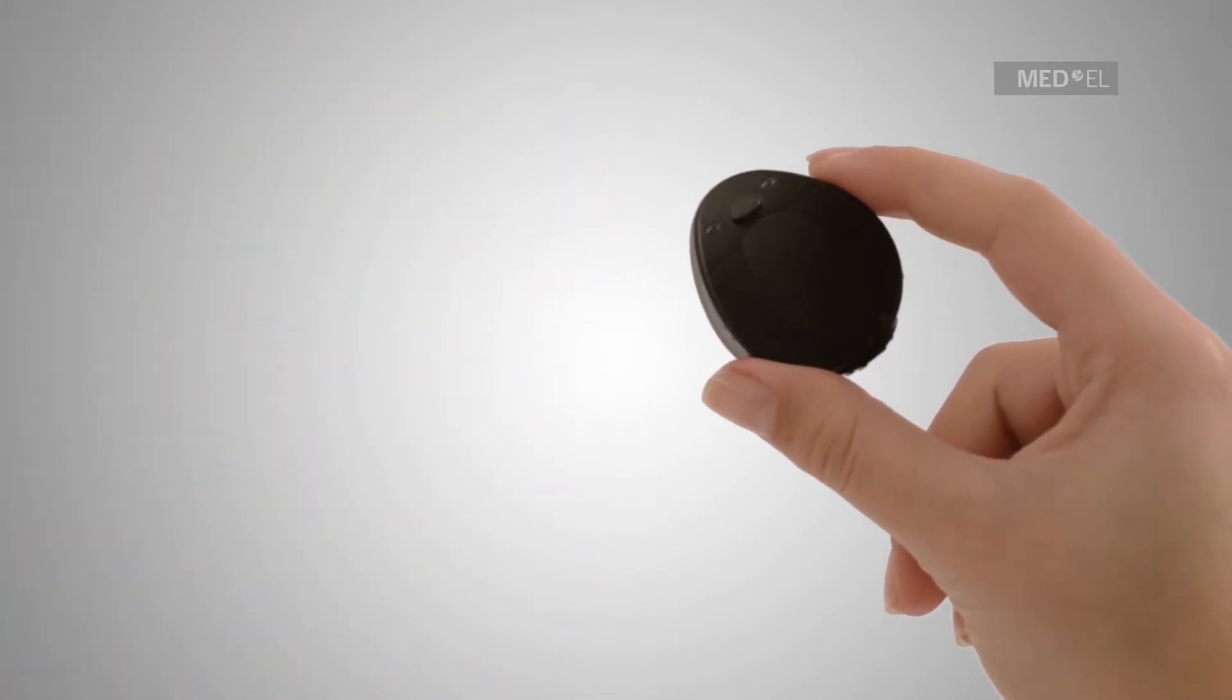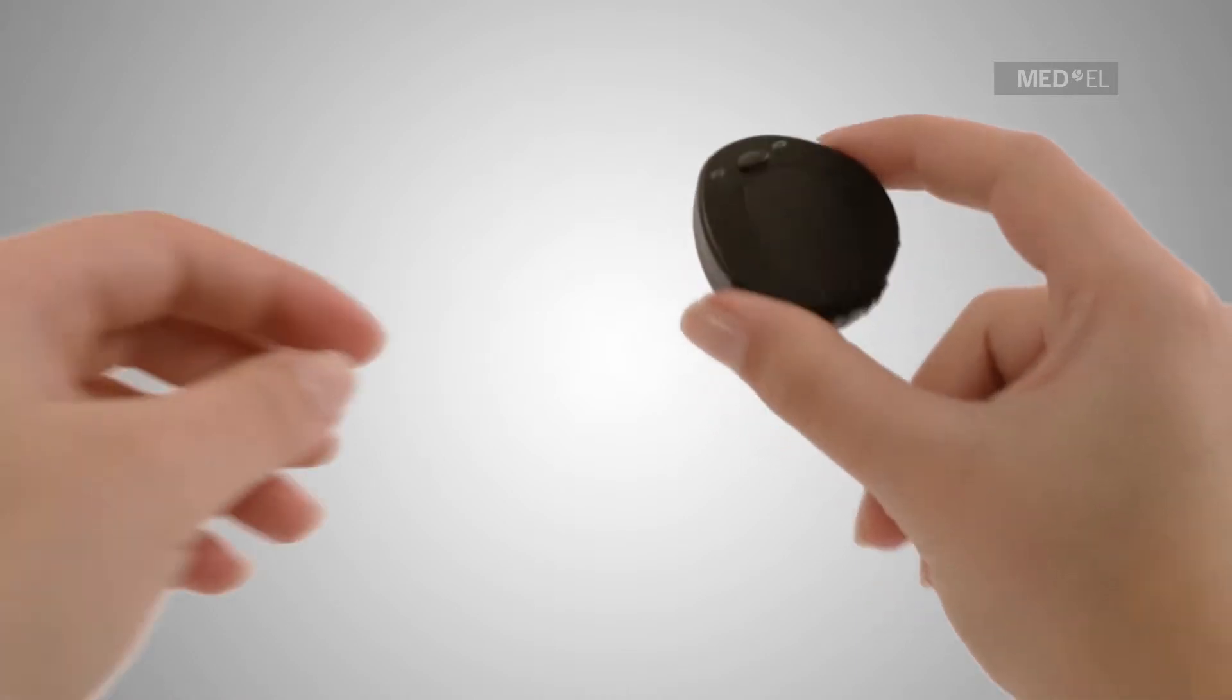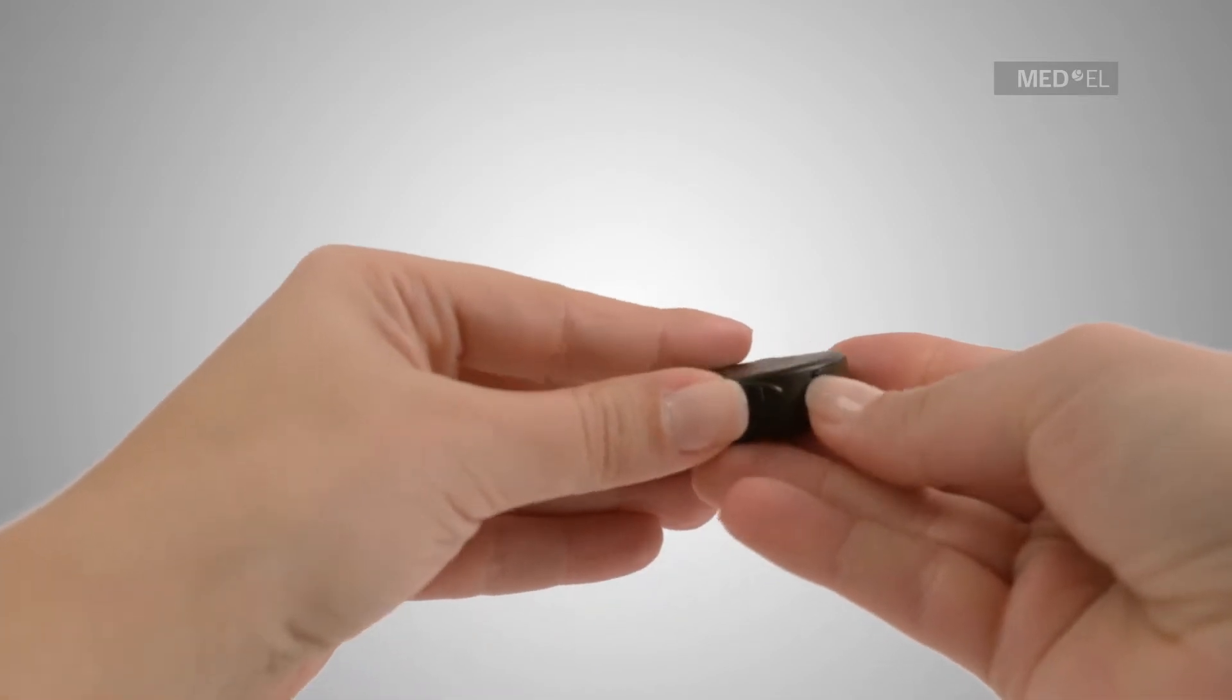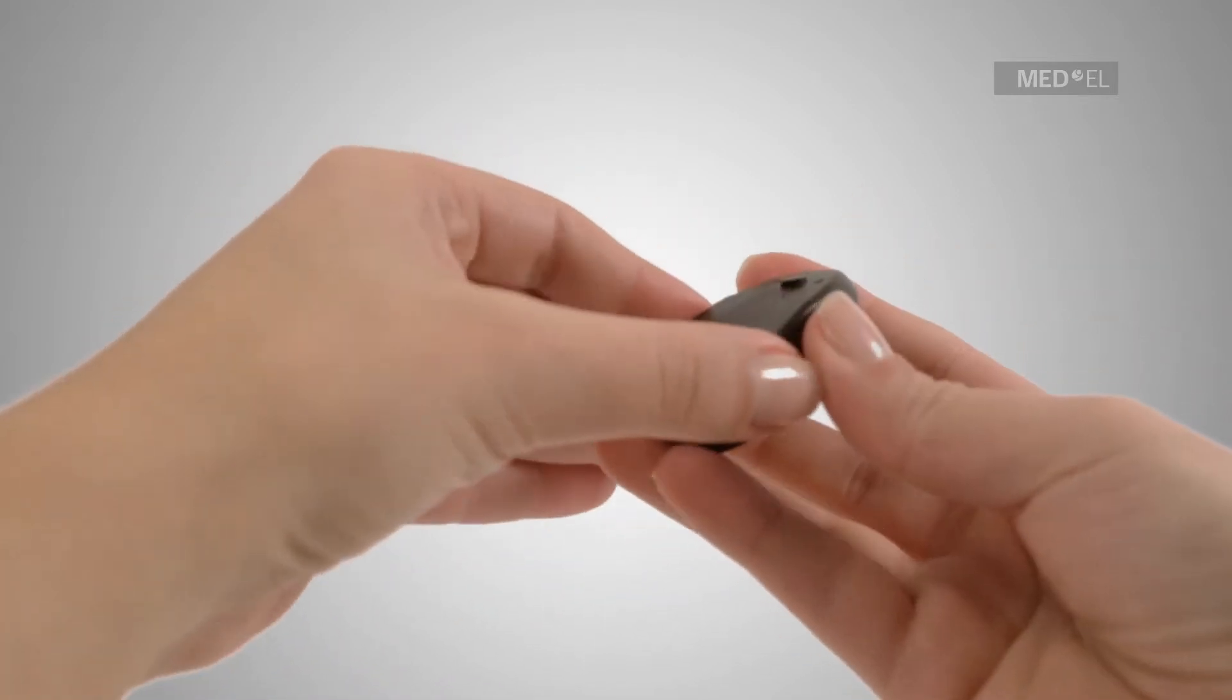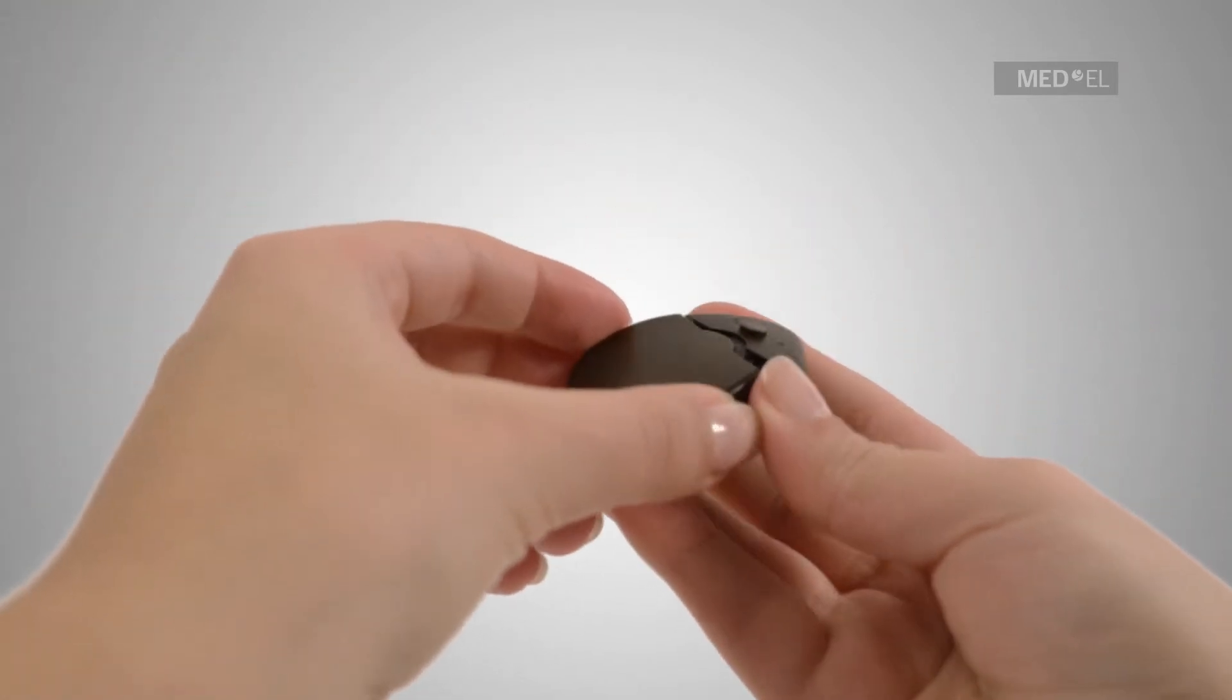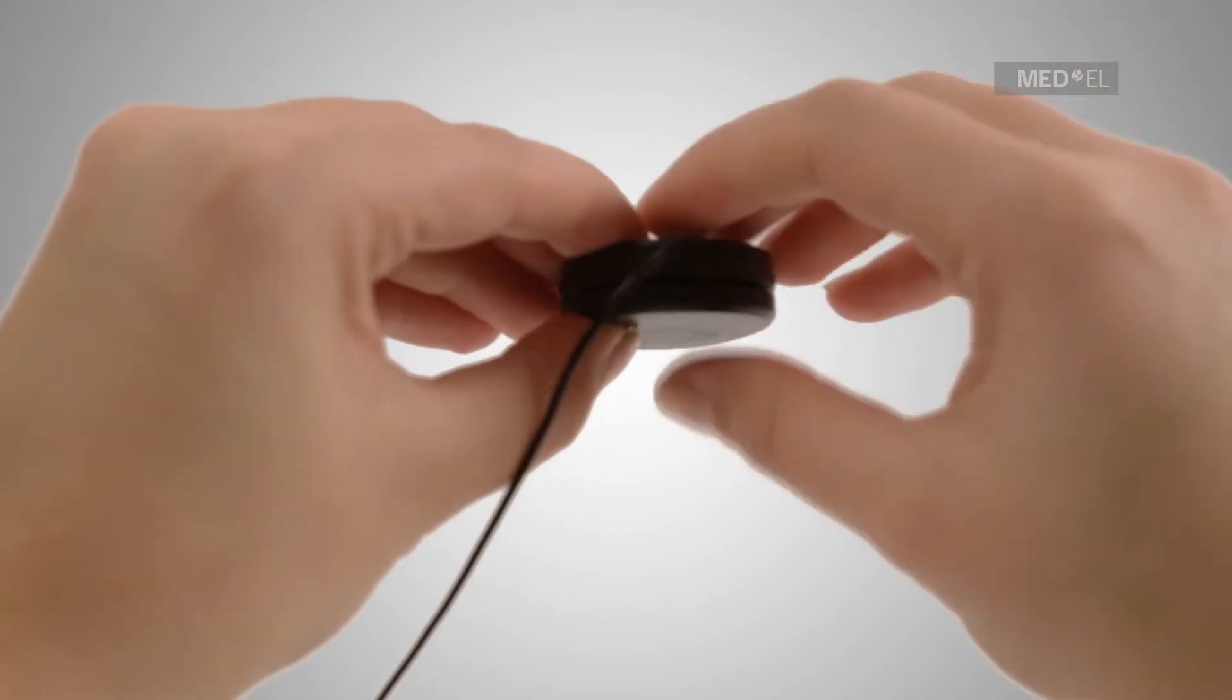To connect the RONDO control unit to the Mini Battery Pack for RONDO, first remove the RONDO battery pack and replace it with the RONDO connection cable. Use the gently landing airplane method to attach the RONDO connection cable, then lock it into place.